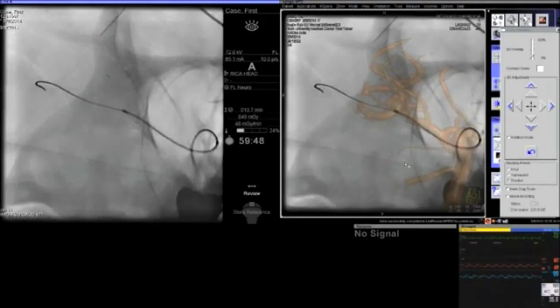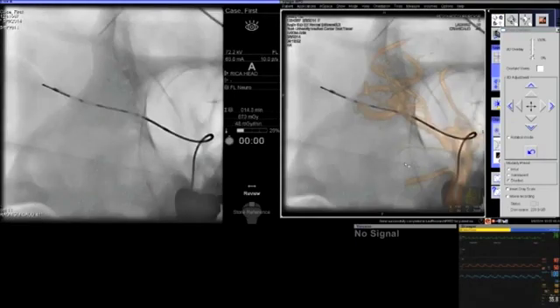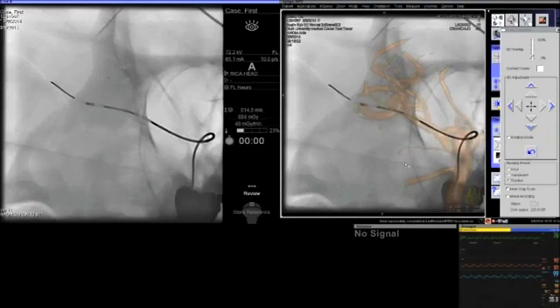And this has to be done without moving the first stent. You saw just there, we were able to find a little space, and then you pass the microcatheter through that cell without moving the first stent. Now, as we deploy the second device, we are careful to obtain, again, good distal purchase, but then very little into the M1, so you don't have a lot of overlapping devices into the M1 segment, but you have a very comfortable protection of the neck of the aneurysm.